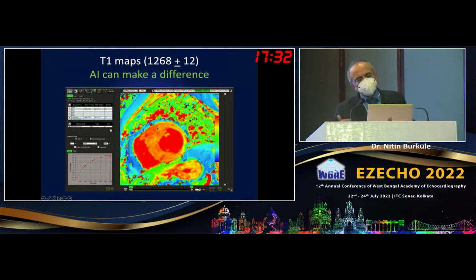Actually, this will help the AI to create the LGE maps without using gadolinium, and this work has already been done. So probably in future you will know the extent of replacement fibrosis from the AI analysis without using gadolinium, because AI will read this image much better than us and can tell you where the fibrosis is and can create the map of LGE.